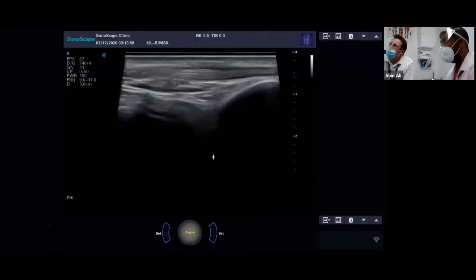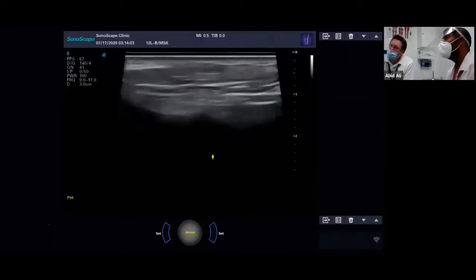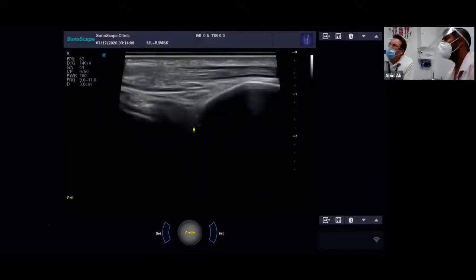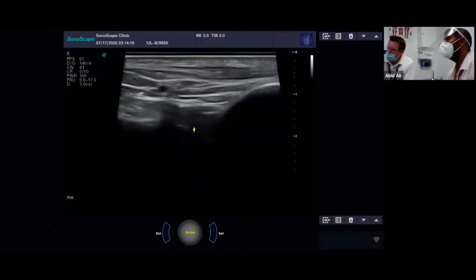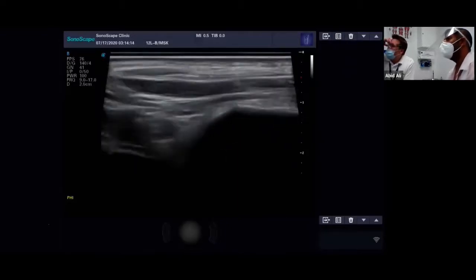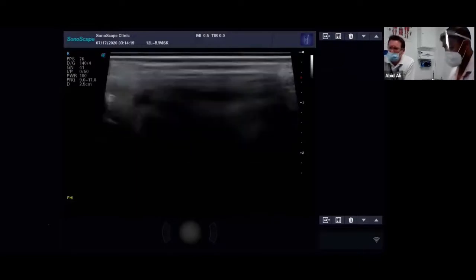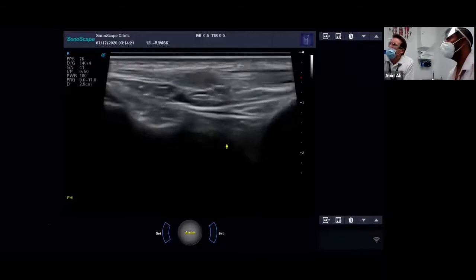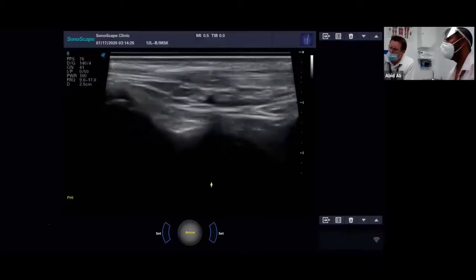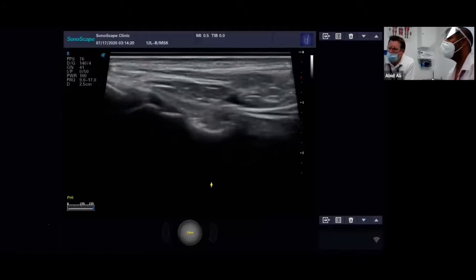And what we're looking for is a sort of V shape. Can we have a little bit more superficial, please? So we're just going to go out a little bit more. Now we can see the talus appearing. It should be. Just see the bone here on the left of your screen, if I pause that.